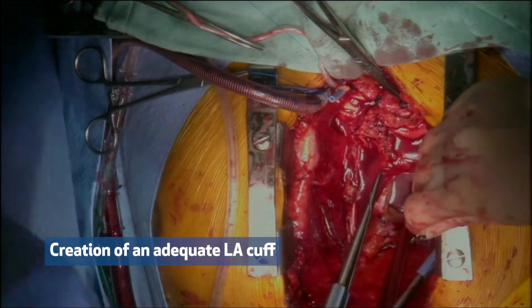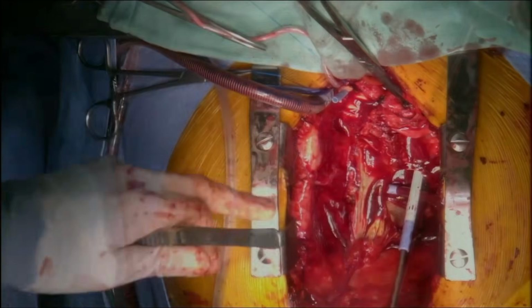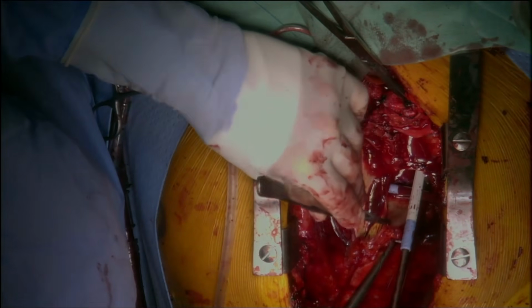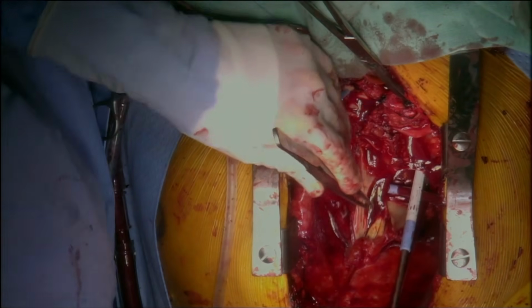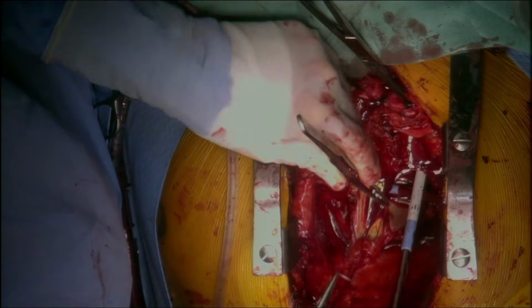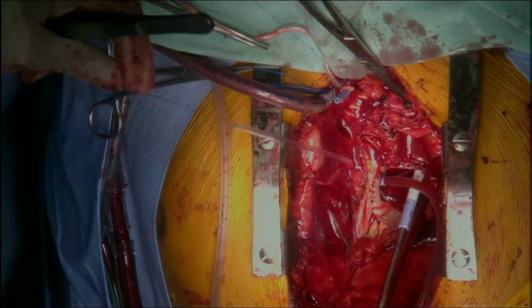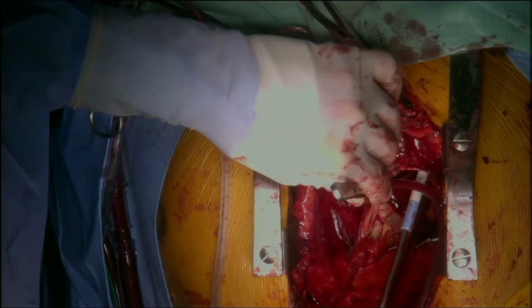An adequate left atrial cuff was created, and the sutures were positioned in order to move the left atrial cuff towards the right side of the chest. And a left atrial vent was positioned through the right superior pulmonary vein.